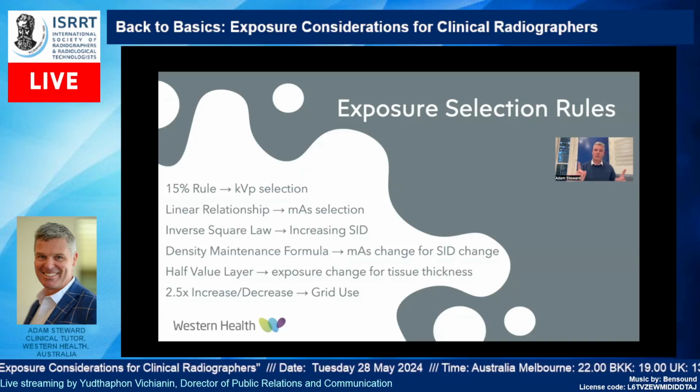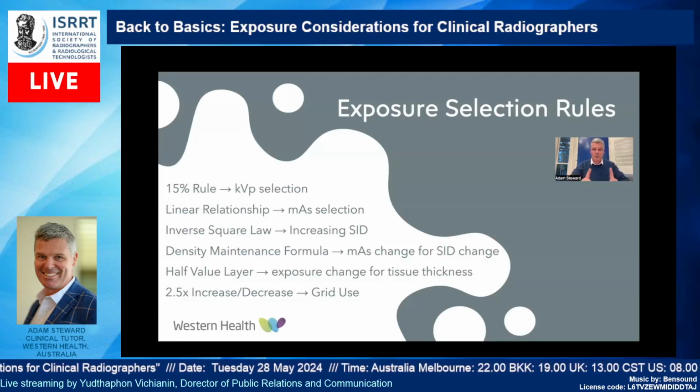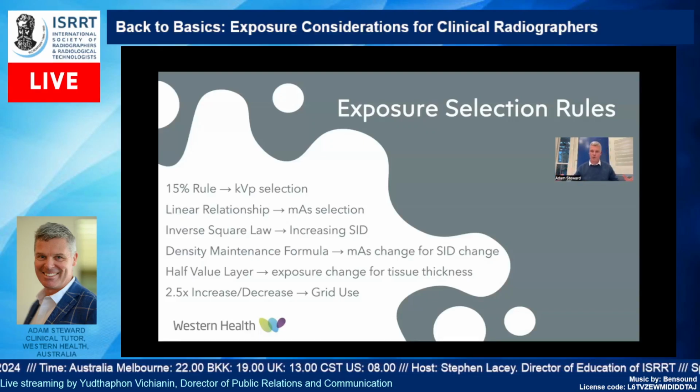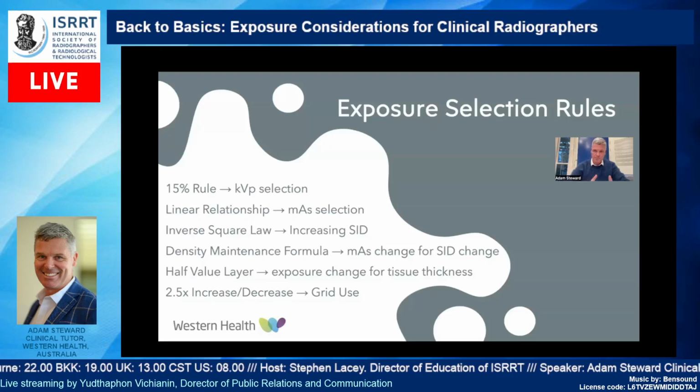The increase in your SID will still work on the density maintenance formula, the inverse square law. It still holds true, and the density maintenance formula can be utilised in order for you to make mAs changes to compensate for the distances that you're increasing. All right, and try to be aware to maximise your SID, because it is going to have much better outcomes from a skin entrance dose perspective for your patients.